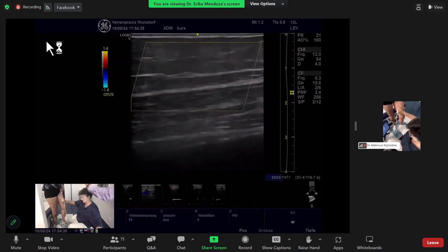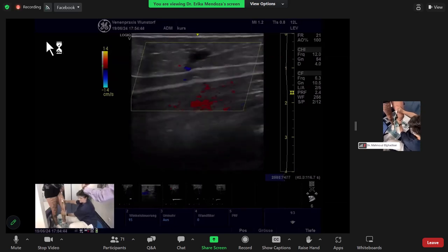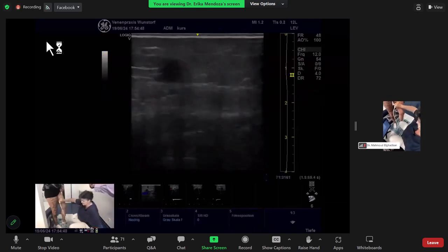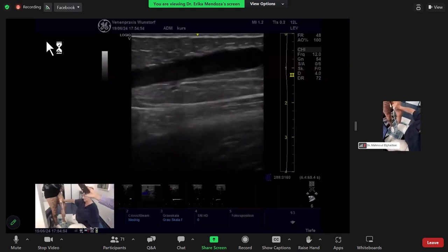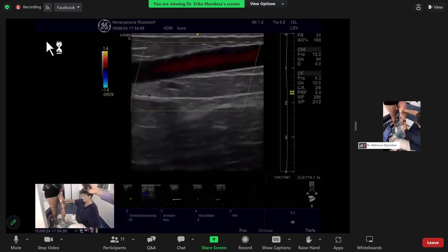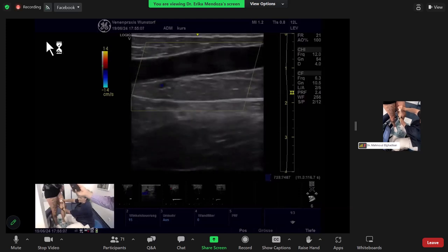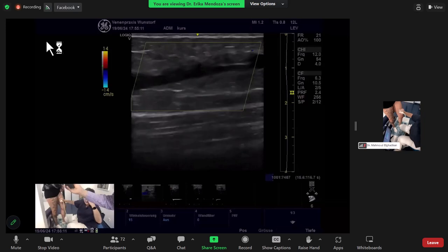Give me a second. Lift the toe and lower it. I don't know if I'm at the correct place. Here. Okay. Lift the toe, lower it. You have a reflux there. And if I close the tributary further down, lift the toe, lower it, you have no longer reflux here until you open the vein, which is connected tubes.